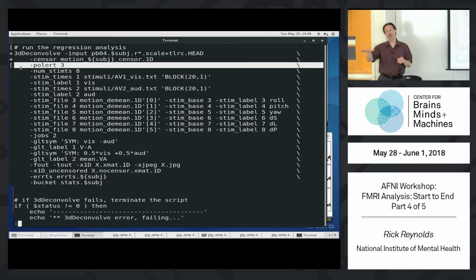If you've got a group of good subjects and a group of higher movers, you have to be consistent. So then you might have to use a higher censoring level, and maybe most of your good subjects won't get censored. But that's a messy aspect. But you'd rather remove the bad data. If you know the subject moved, don't corrupt your results.